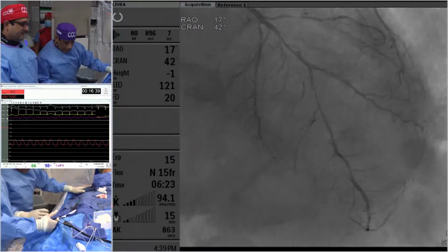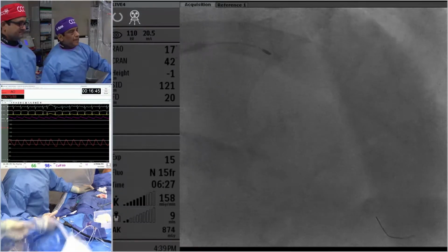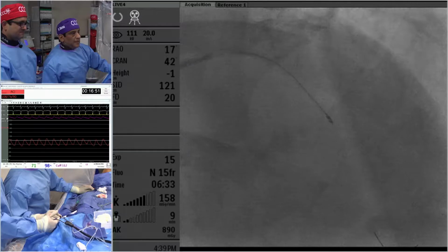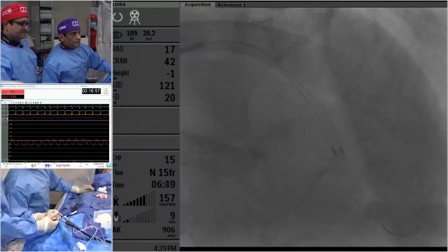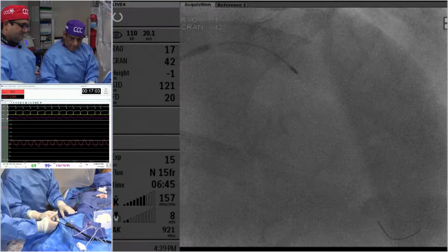But let's see. We'll do a lot of balloon dilatation. And just for completeness, this was evaluated by a surgeon? Yep. And this patient was last time, because of the diffuse disease in the vessels, even the RCA was not a good target. Yes, we saw that, the outflow. Yeah, I guess it would be hard to do a limited LIMA and find the target spot in such diffuse disease.